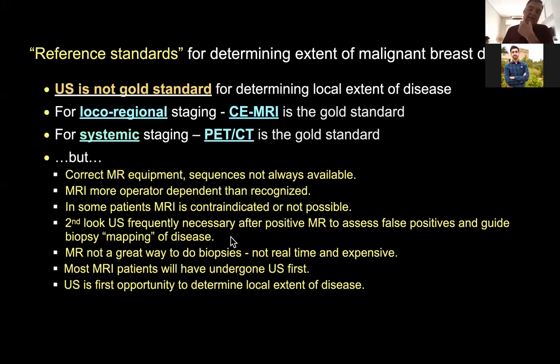And even after MR, second look ultrasound is often necessary. And MR is not a great way to do biopsy. So if we do find something on MR that suggests it's more extensive than we originally thought, I usually take them back and do a second look ultrasound. I try to do the biopsy under ultrasound guidance on second look ultrasound. And the truth of the matter is almost all the patients who get MR will have undergone ultrasound first. And during that first ultrasound is our best opportunity to actually correctly stage it.